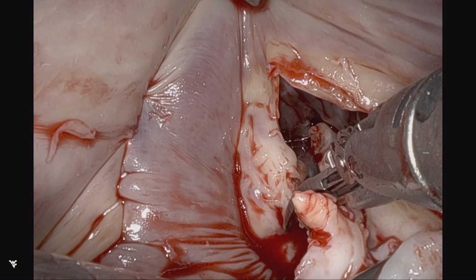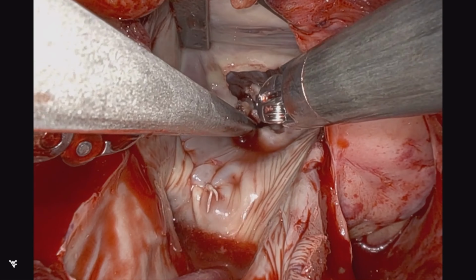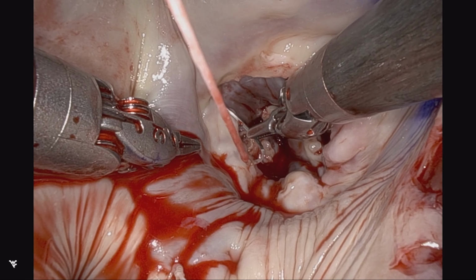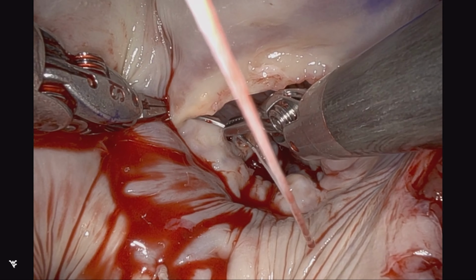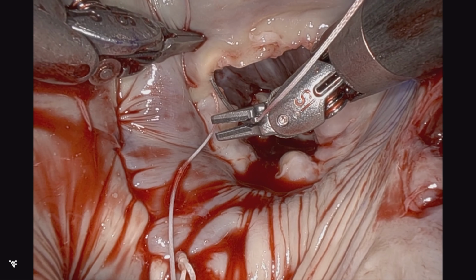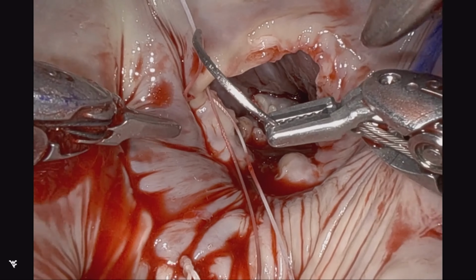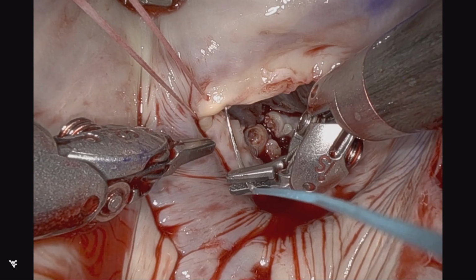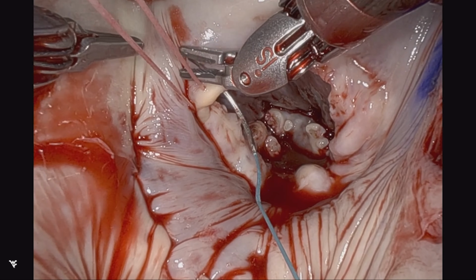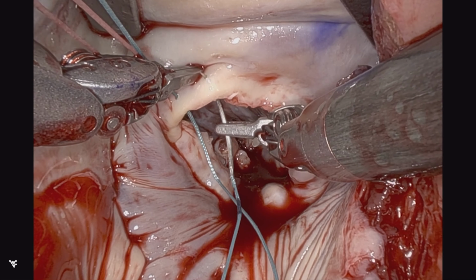I tend to truncate these at the tops of the papillary muscles, but not through the papillary muscle. And this is already very well anchored. In rheumatic disease, there's often not a huge reason to do total cord sparing. Likely posterior sparing should be sufficient, since the cords are so fused between the anterior and posterior cord groups that essentially does the same thing for these posterior preservation techniques to preserve all papillary muscle continuity.